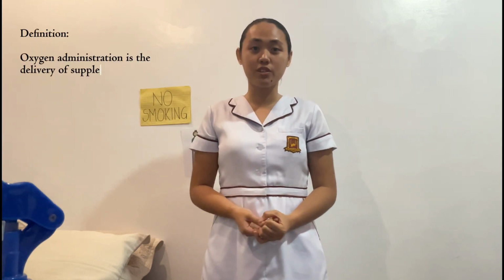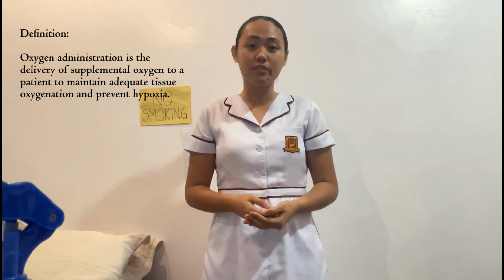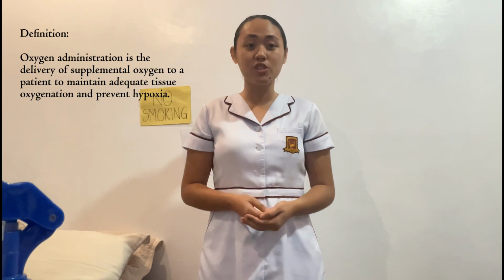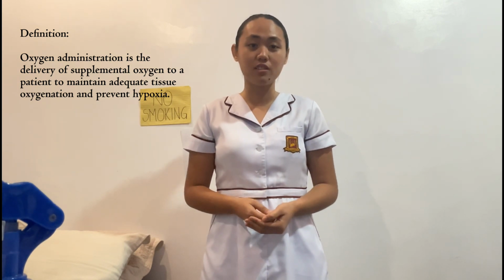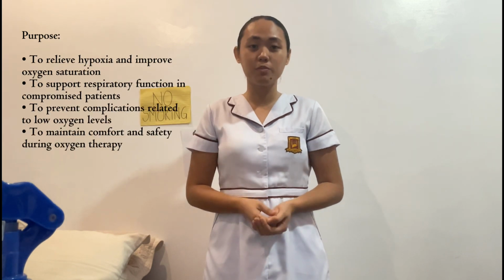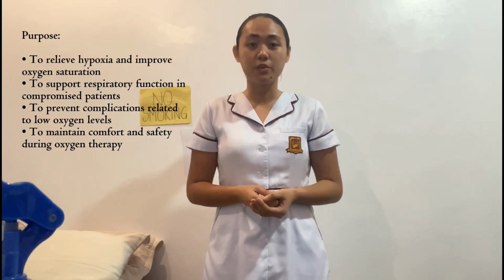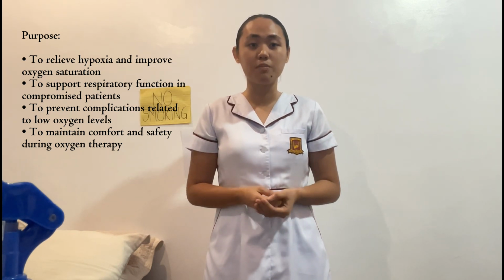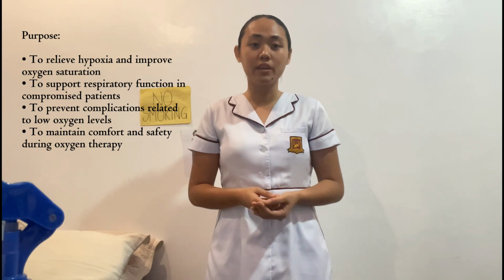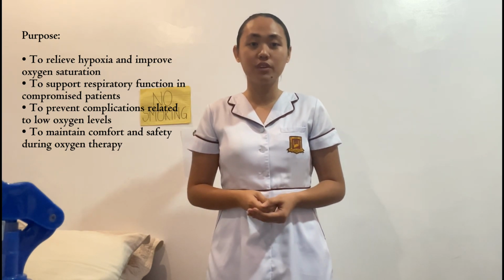So, the definition for this procedure: oxygen administration is the delivery of supplemental oxygen to a patient to maintain adequate tissue oxygenation and prevent hypoxia. So the purpose for this procedure is to relieve hypoxia and improve oxygen saturation, to support respiratory function in compromised patients, to prevent complications related to low oxygen levels, and to maintain comfort and safety during oxygen therapy.